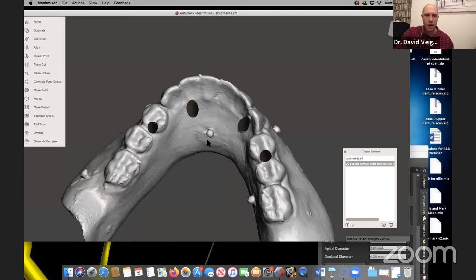Okay, so are these initially non-engaging abutments? I think I answered that above. I try to, as much as possible, always use straight abutments, which are non-engaging. But if I have to use angled abutments, then they will be engaging, so they'll have a hex on them.